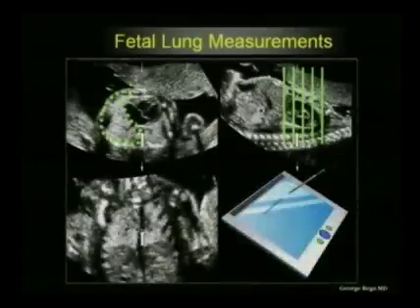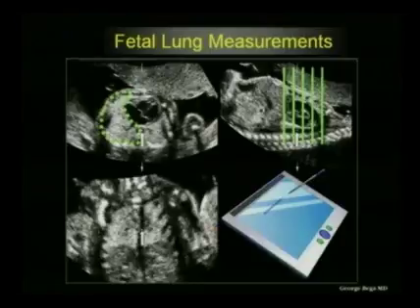And it has been seen that the percentage of error has been less than half by using volume-derived techniques. This is another very exciting part of studying the fetal growth, but much more work will need to be done to validate this data in a wide variety of clinical settings.